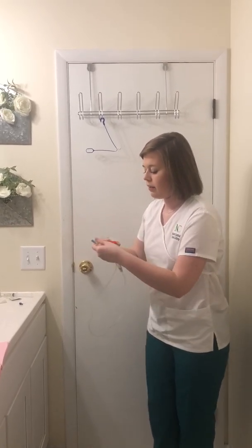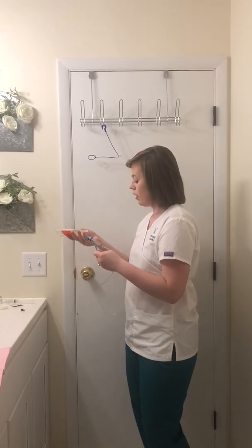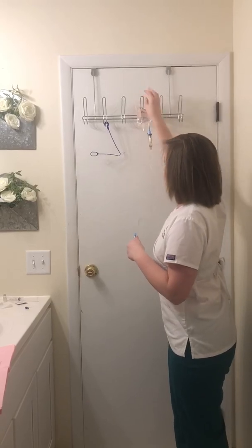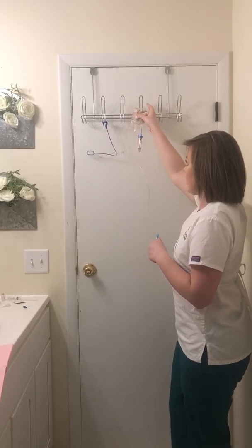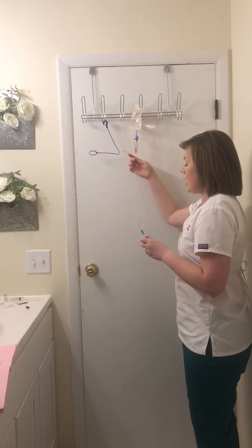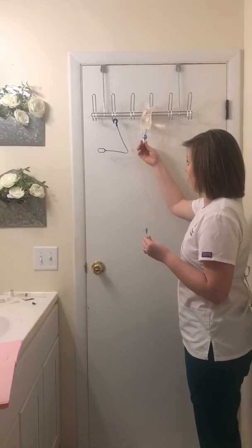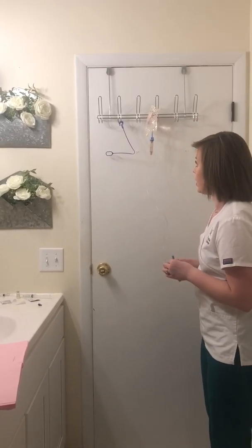Okay. And then we want to make sure when we hang our bags that our primary bag is lower than our piggyback. So if this was my primary bag right here, I would make sure that my secondary bag is above. And then I would just squeeze my chamber and make sure that's filling up. And then I would unclamp my primary tubing and my secondary tubing so that way it could flow through. And if I had a pump, I would connect it to my pump and set my flow rate.